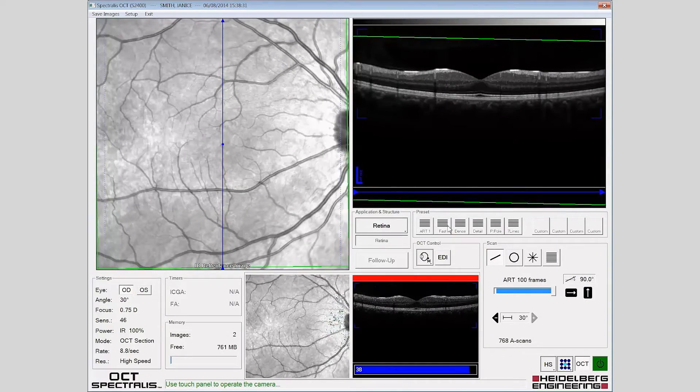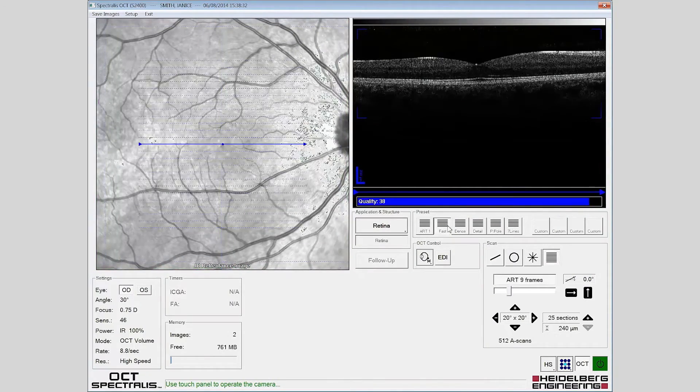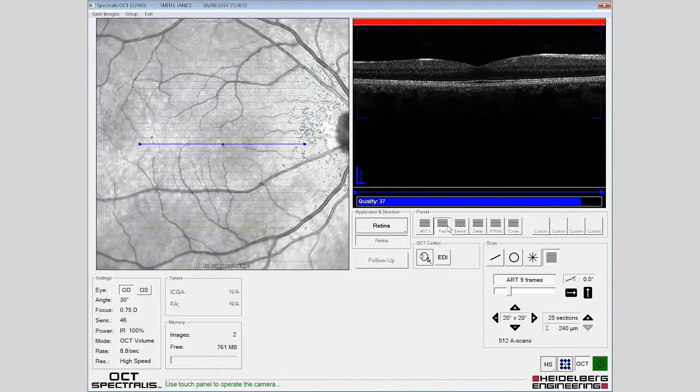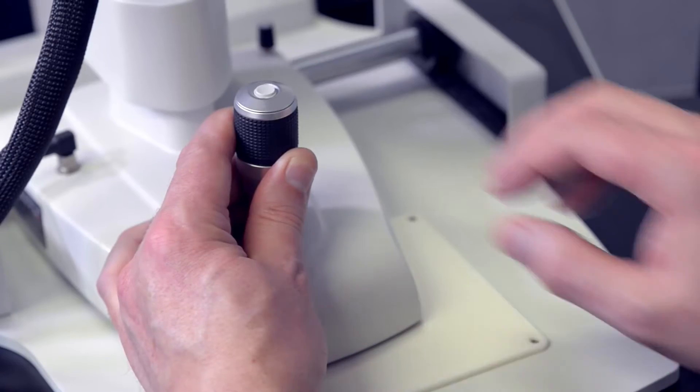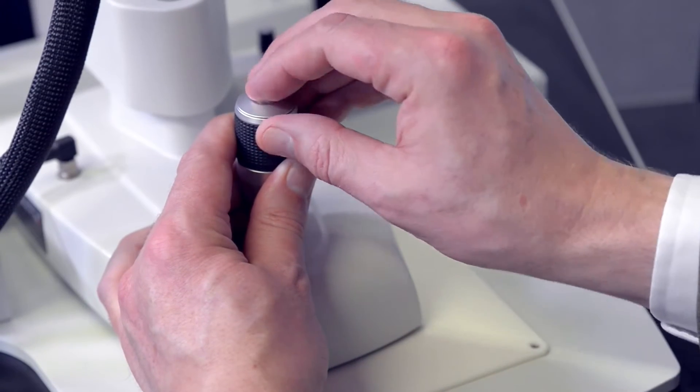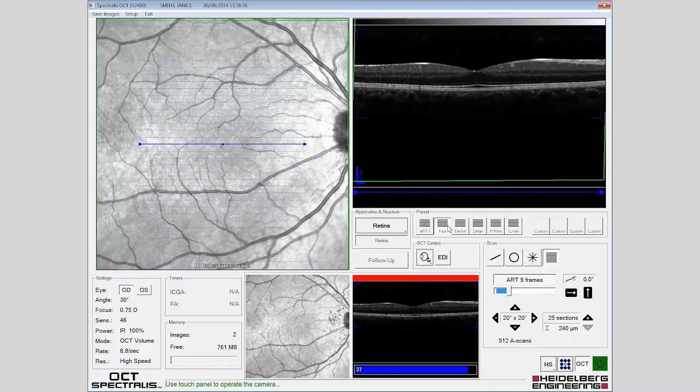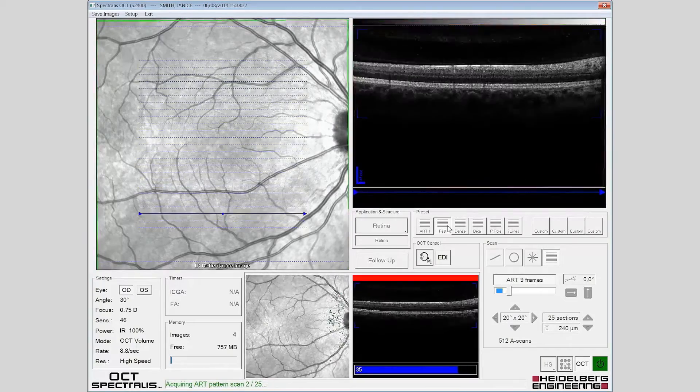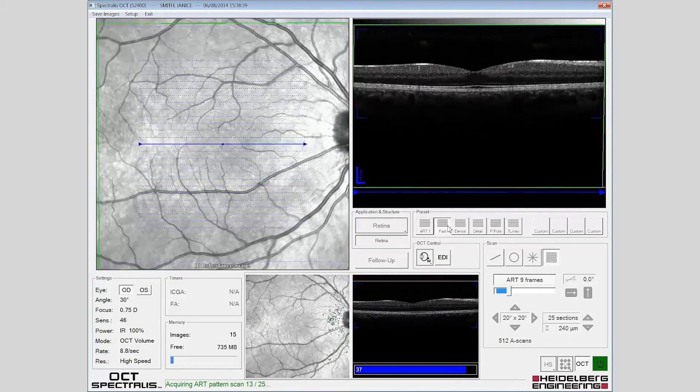Select a volume scan from the retina preset menu. Eye tracking and automatic real-time are engaged upon pressing the acquire button.